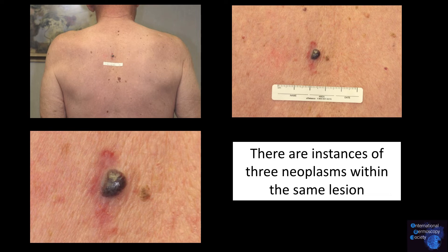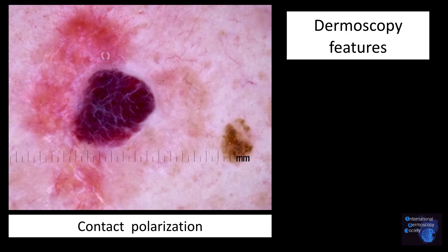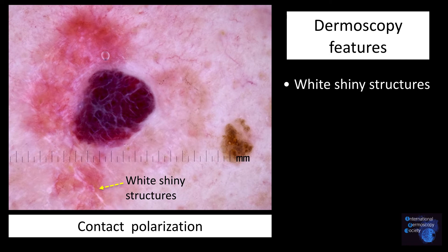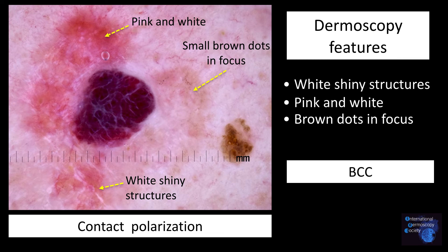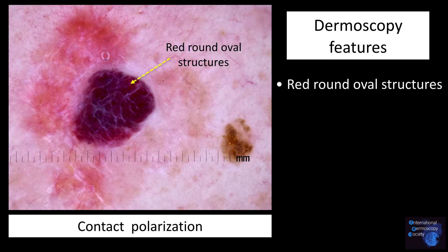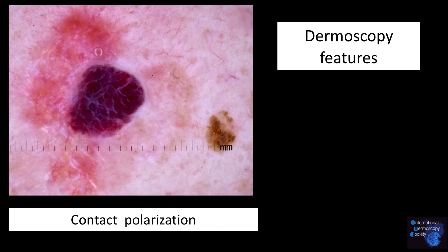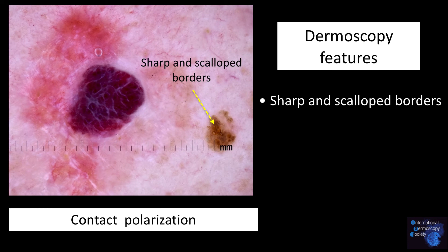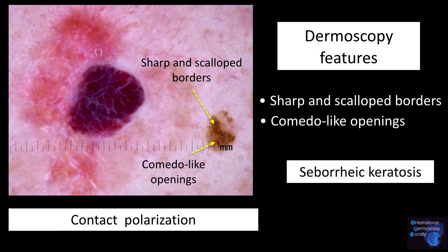There are instances where you can see three neoplasms within the same lesion. Here we see a lesion with contact non-polarized and contact polarized light. With polarized light, one sees white shiny structures, a pink-white area, and brown dots in focus — the characteristics of a basal cell carcinoma. One also sees red round oval structures and white lines — the characteristics of a hemangioma. In addition, one sees sharp and scalloped borders and comedo-like structures — the features of a seborrheic keratosis.